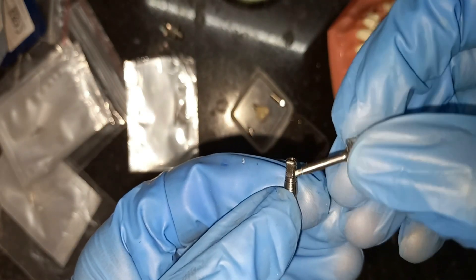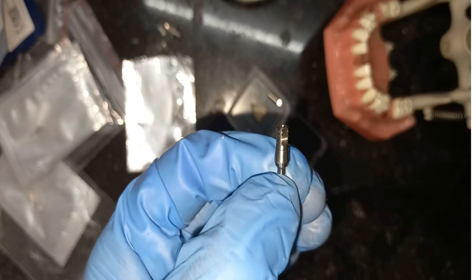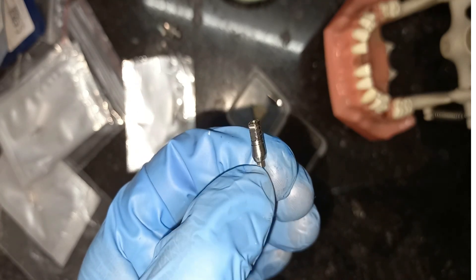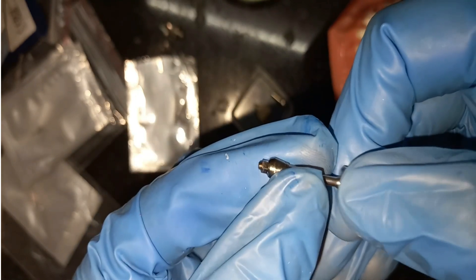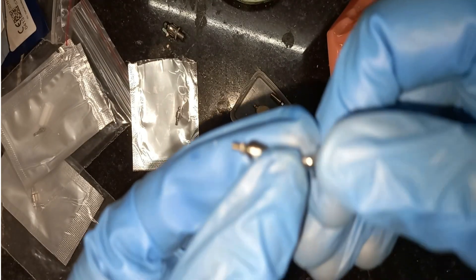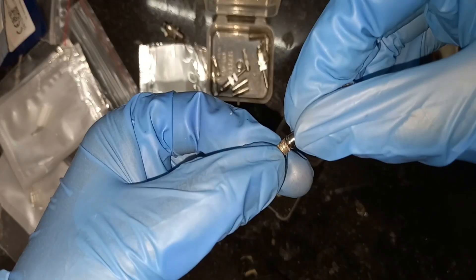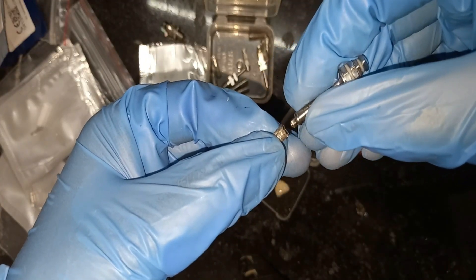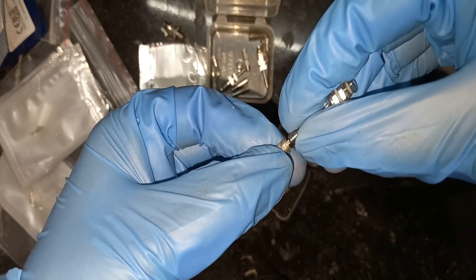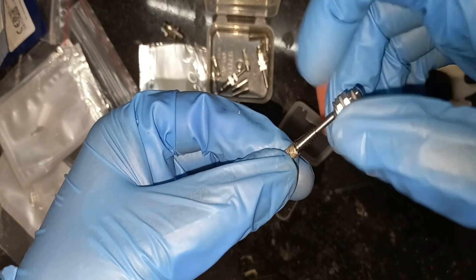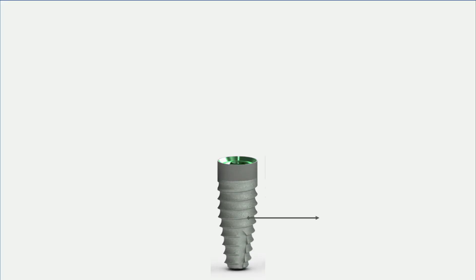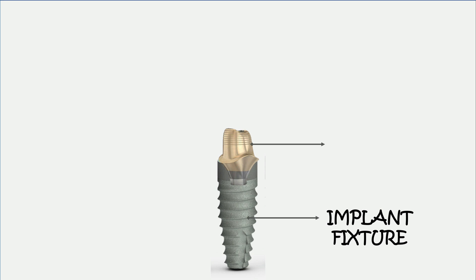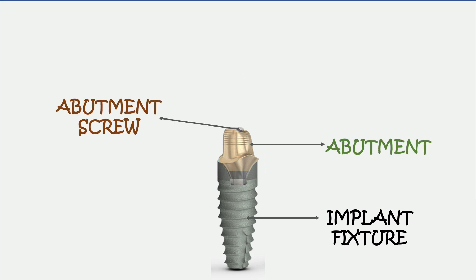Now we'll move on to the parts of the abutment. This is a prefabricated abutment. In this abutment we have a screw — as you can see in the video — with the help of which it is connected to the implant. Since this is a cement retained abutment, the prosthesis is cemented over it. So we have the implant fixture, then the abutment connected via the abutment screw, over which the prosthesis or crown is cemented or screwed.